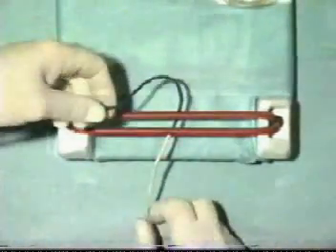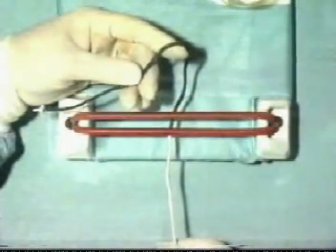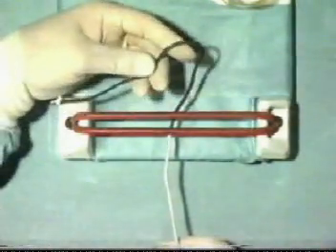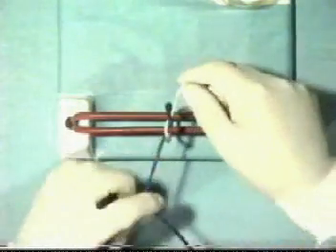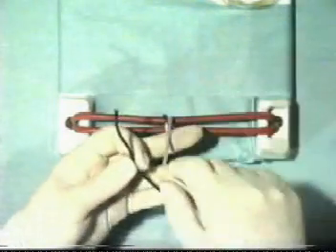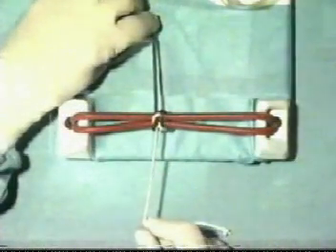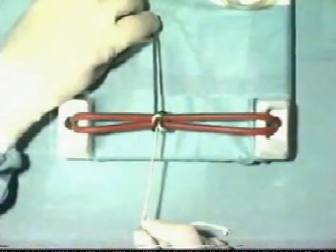Take the short end of the suture in the hand that you will be using for tying. And if it is away from you, we'll use the index finger knot. This is tied as shown here, taking it under the other length of the suture. Then go back, use the middle finger knot, and then snug down. And once again, we see the classic reef knot picture.